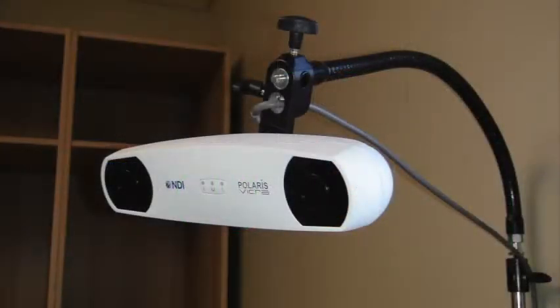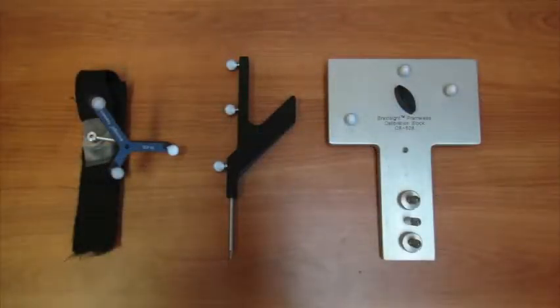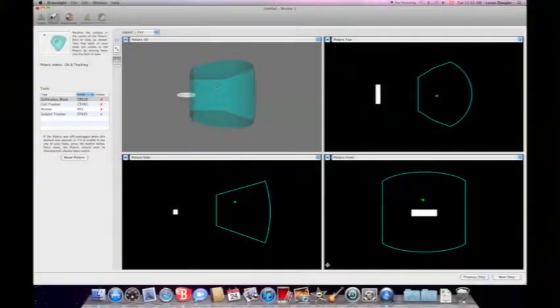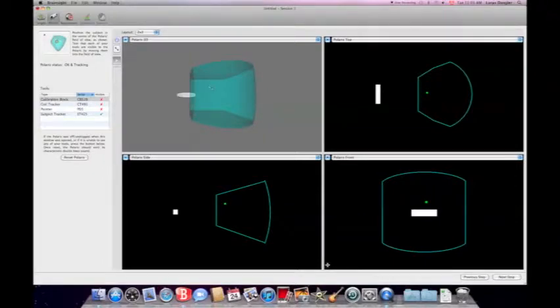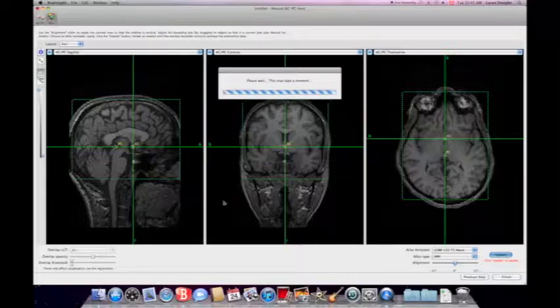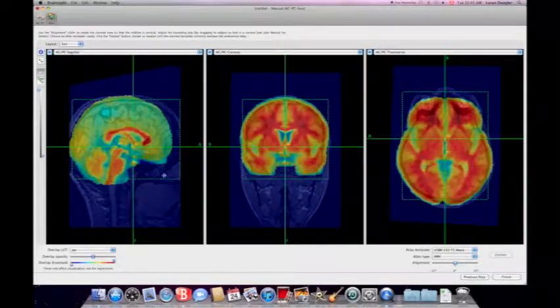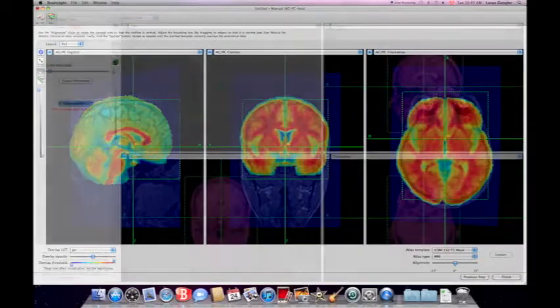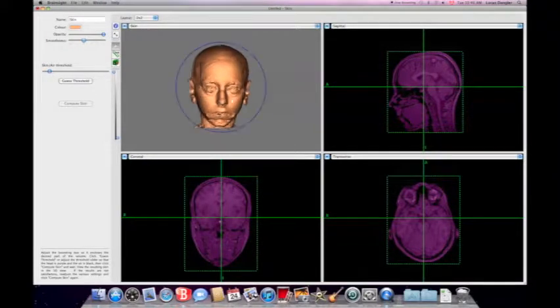An infrared camera and reflective tracking spheres mounted on a headband track the position of the participant in a 3-dimensional coordinate space. Mapping software allows us to use a 3D representation of a participant's brain and head to guide placement of the coil.